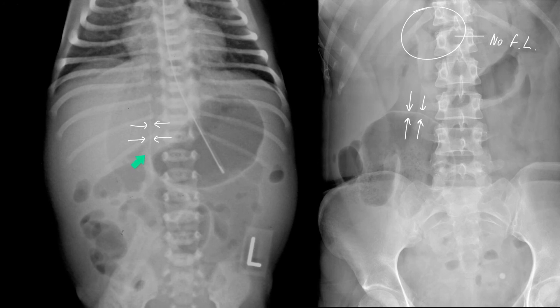So the visibility of the falciform ligament is very similar to the visibility of both sides of the bowel wall. It's effectively a Rigler sign, but of the falciform ligament. The only time you're going to see the falciform ligament is if the x-ray beam is tangential to the ligament.